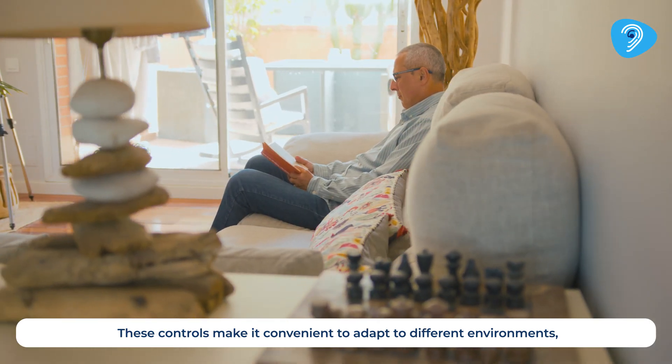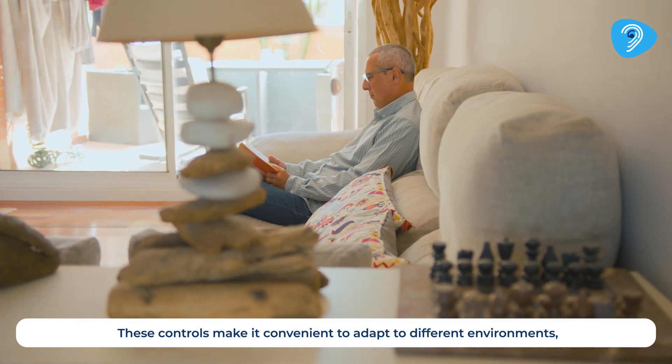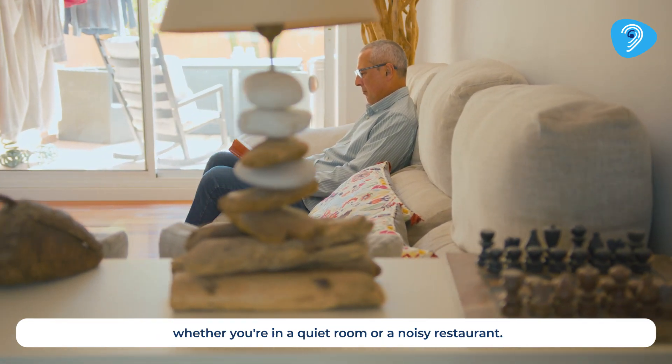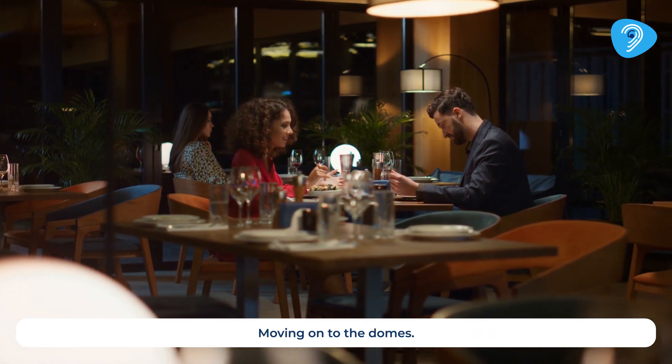These controls make it convenient to adapt to different environments, whether you are in a quiet room or a noisy restaurant. Moving on to the domes.